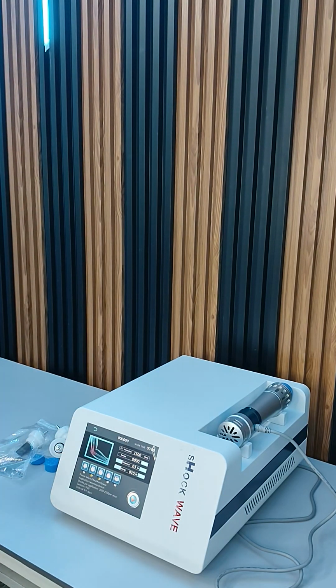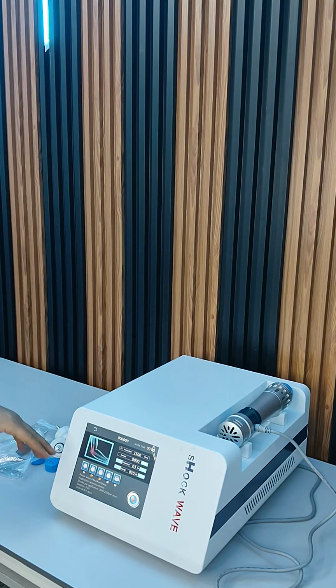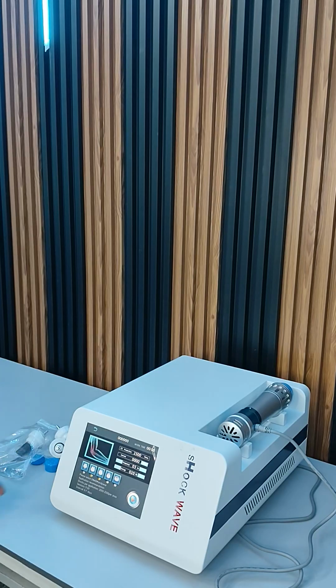Like if I select the elbow program. So in the elbow, you can see the interface. This is the elbow section. You can see 2 and 3 in the yellow color. Please select second and third. The one in the yellow color is the recommended one, and the others, the white ones, are not recommended. However, you can use them, but these are the recommended ones for the joint you have selected.